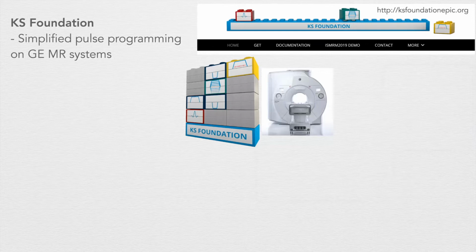Since I've been programming a long time, I know how hard it can be to use the vendor's pulse programming environment to modify an imaging technique to your needs. So in 2016, we decided to try to simplify the way to write software for the GE MR system.